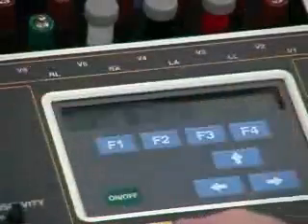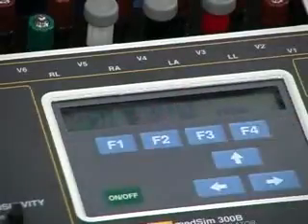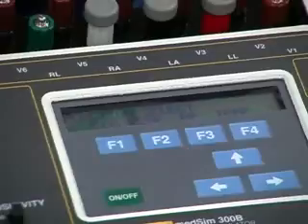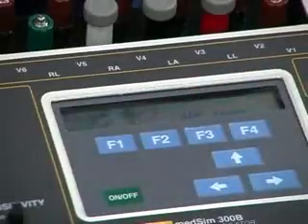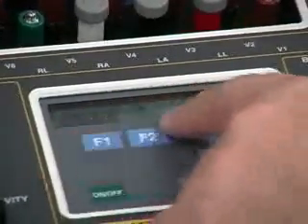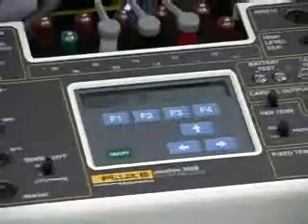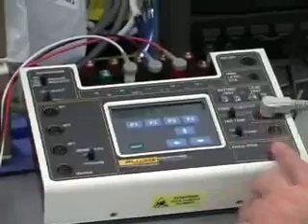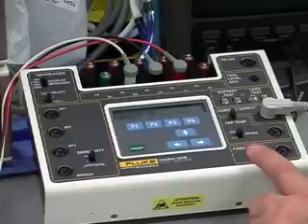Blood pressure, soup to nuts, both for static and dynamic. Temperature, we have 2 channels of temperature. This one is variable temperature, and that's all output right here. So you select either 400 or 700 series YSI probe, 3 fixed values, and then the other dynamic conditions. So you can check the temperature trend capability on the monitor with this. It also includes one fixed temperature at 37 degrees C, 98.6.